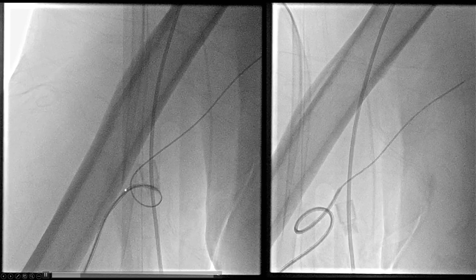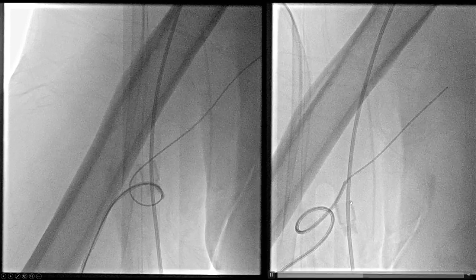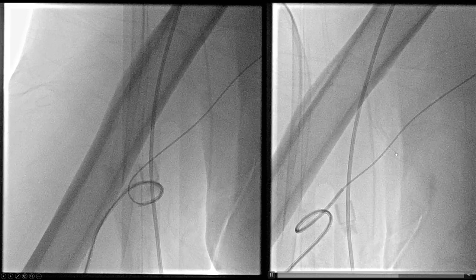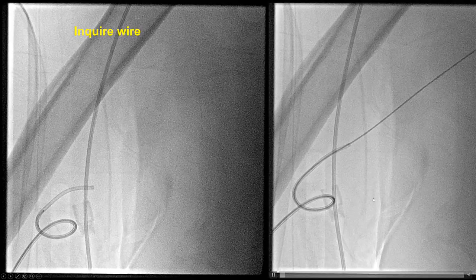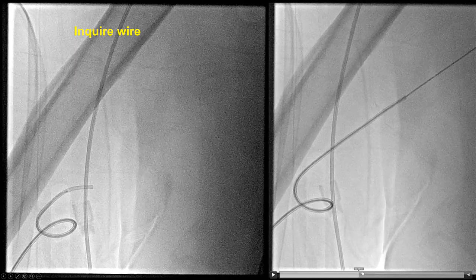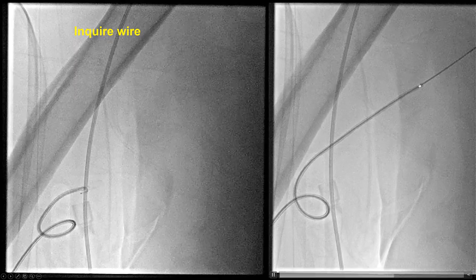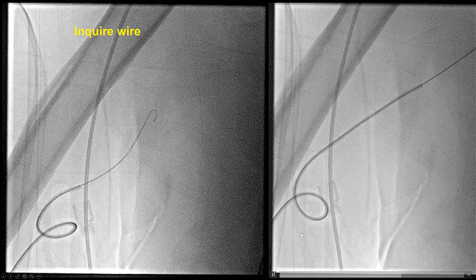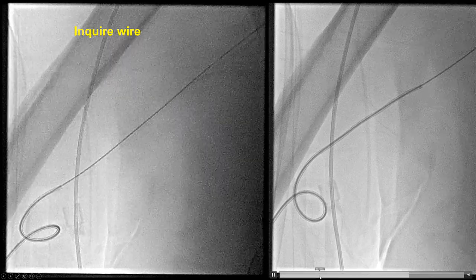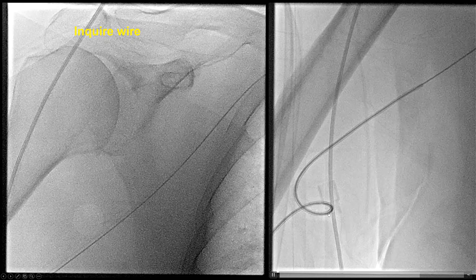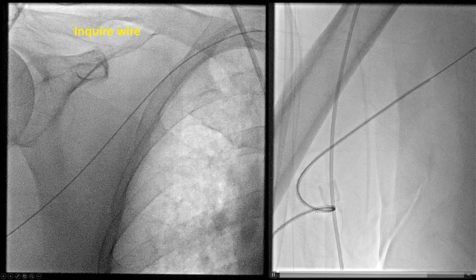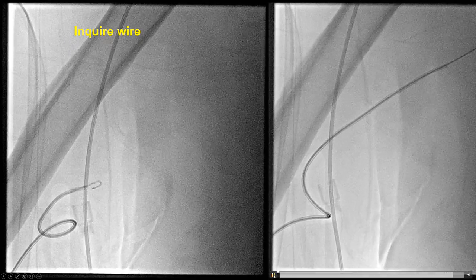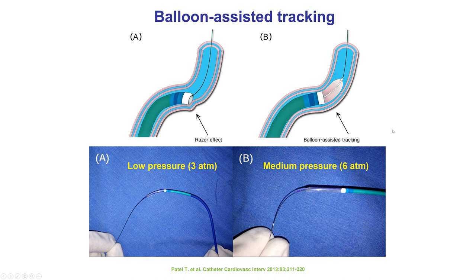This is another example of a radial loop that is hard to negotiate. The catheter made it partially through, and with persistence of the operator and slow advancement, eventually with a gentle rotation, the catheter and wire straightened the vessel. After the vessel was straightened, the catheter could be advanced without difficulty up into the aorta.